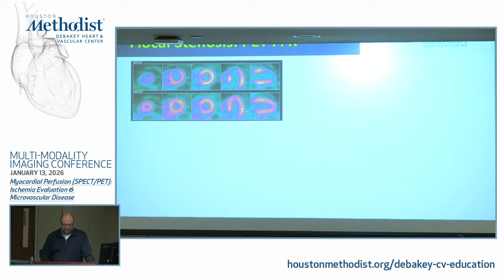All right, Dr. Ilyas, where's the microphone next to you? What do you see here? I know you haven't done PET, but this is easy. Yes, so we have an anterior wall and apical defect that goes away with rest. So clearly a large anterior defect. So the question is, where is it from? The proximal segment of the anterior wall is not affected, but then you see the mid anterior, I would say, so it's a defect in the LAD.